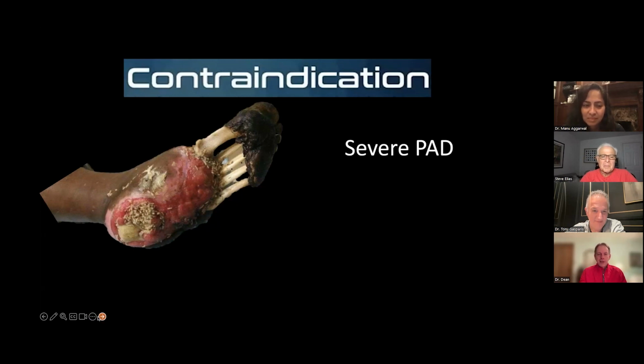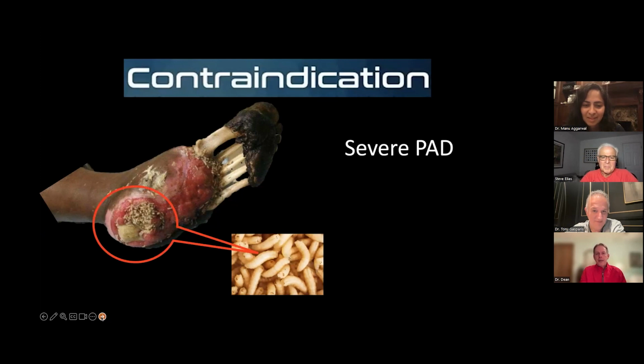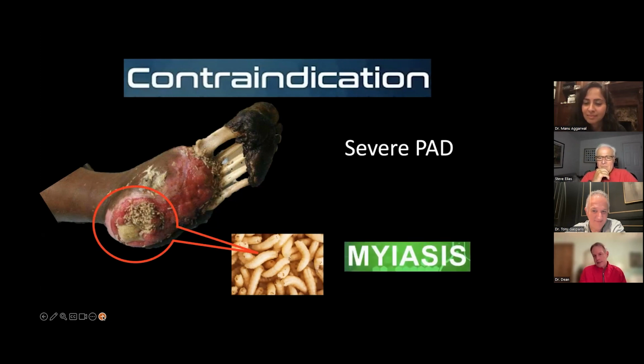And our second contraindication, let me give you a little close up here, would be a maggot infestation or any type of infection. Now, just as a fun tip here, are you familiar with what the medical term is for maggot infestation? It's actually myiasis. So that's a little take-home point. I'm hoping to interject that at a cocktail party sometime.